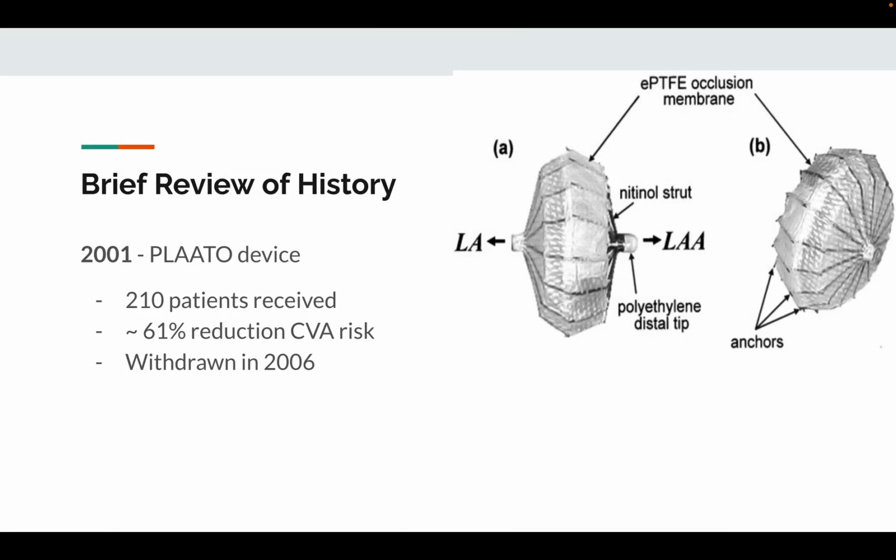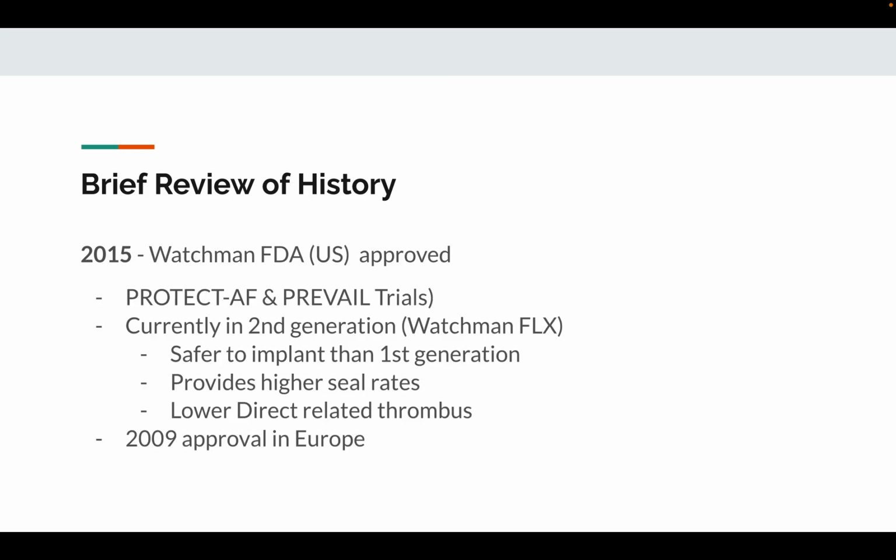This is just designed to be a brief review of left atrial occlusion devices. So this has been going on a little over 2 decades. The first device was a PLAATO device. A little over 200 patients received this, and they started to see somewhat of a risk reduction in stroke, but this was withdrawn about 5 years later. And I'm not sure why it was withdrawn, but nonetheless it was.